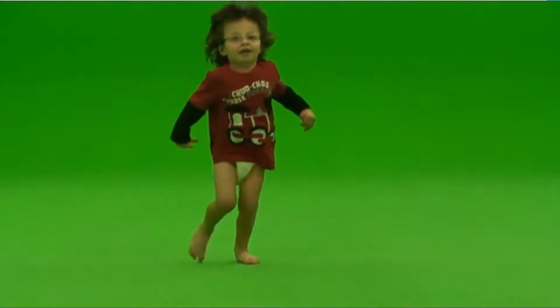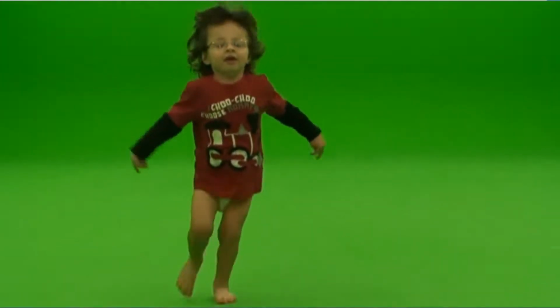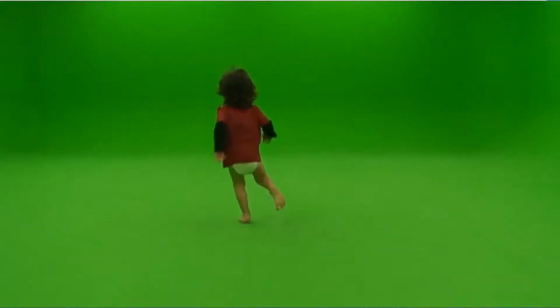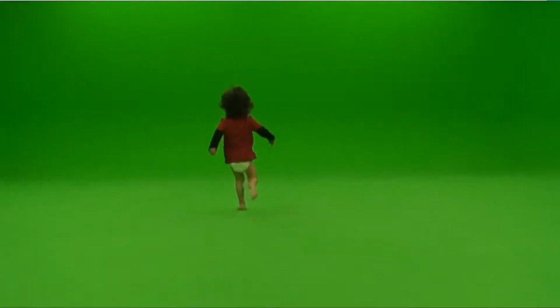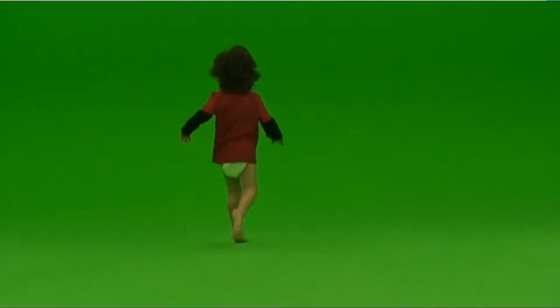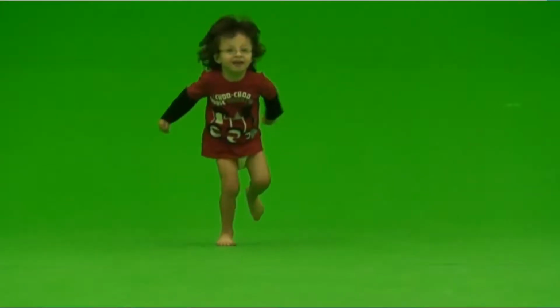We're seeing some of these effects up the chain here with this young fella, coupled with a lot of bad practice. These are things that we can change through proper bracing and through working hand in hand with physical therapists to break down some of these motions and some of this practice in poor positioning. We can in fact make a significant difference.